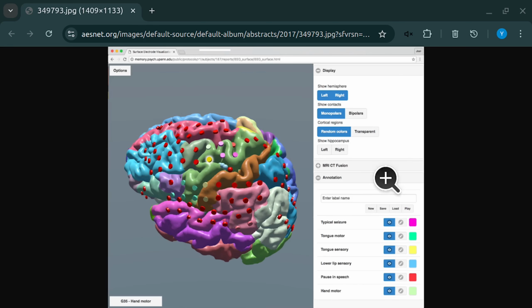And then we could have a slider for each electrode, or all of the electrodes, if they are deep brain or surface, or anywhere in between. So we're placing the electrodes and then we decide the depth of each. In this case, I don't think it's possible.